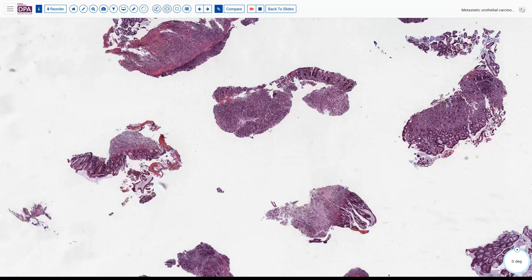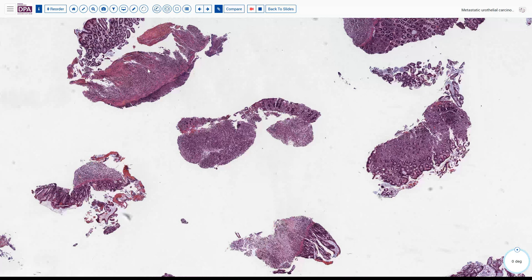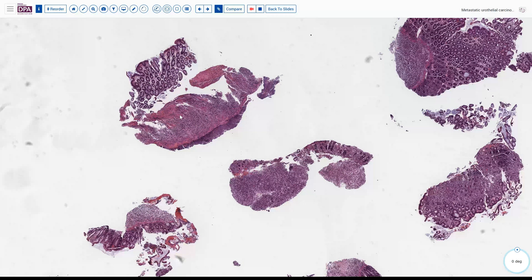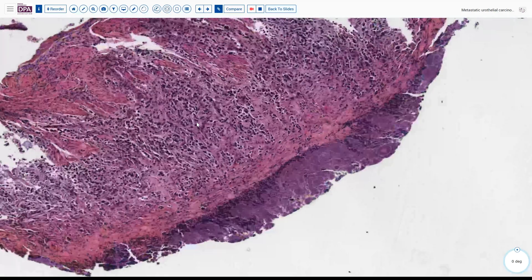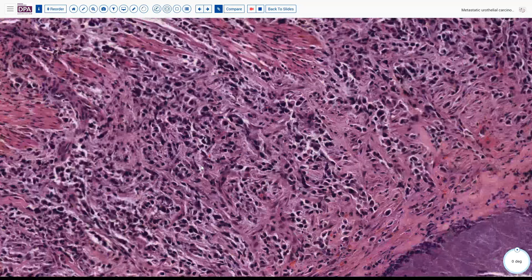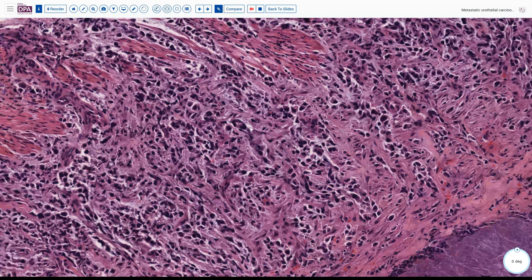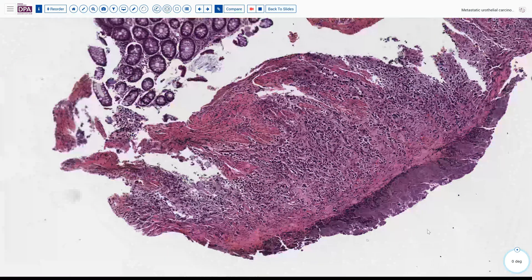We see an abnormal pattern in fragments like this, without evidence of the usual disorderly glandular appearance. So this is a bit of an atypical appearance from low magnification. We can come in at a higher magnification and see that this is an infiltrated pattern of tumor cells — very dark, fairly small-looking cells — and there's evidently some ulceration.